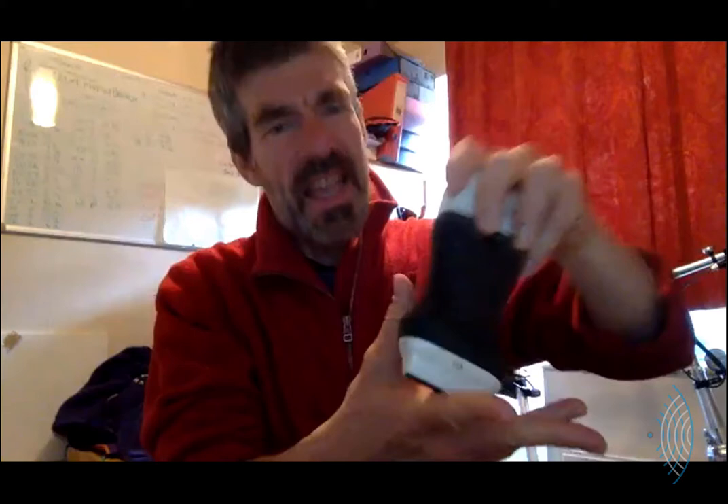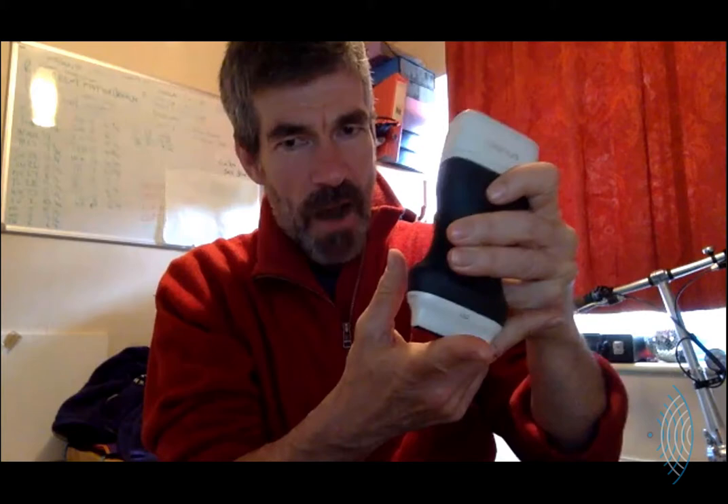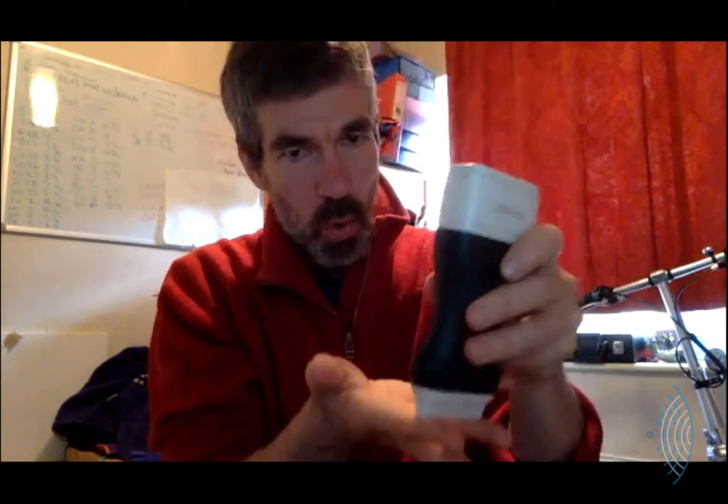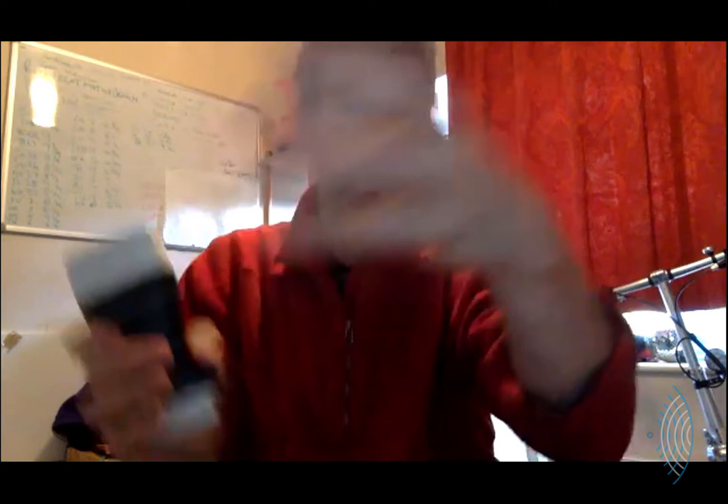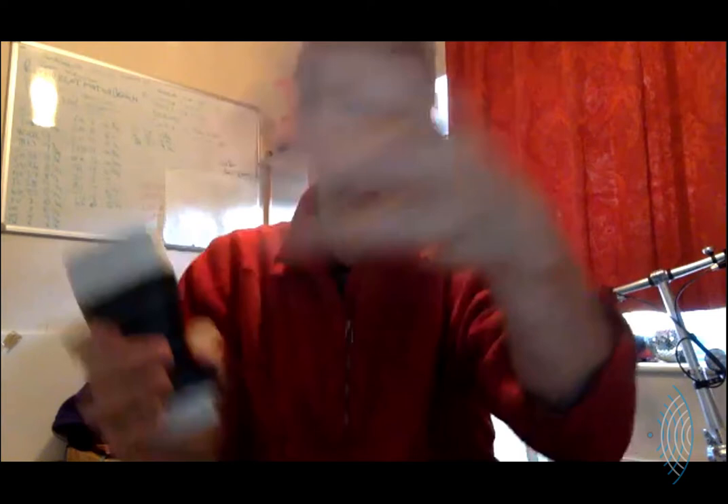I'm not trying to use my anatomical model to tell me where the tissues are. You're looking at the nuances from what's coming from the image. I look at the biceps tendon — whatever the bigger tendon is — and because I only move my probe at 90 degrees, it only ever goes like it's on a track. When I'm following something, I follow it like a train; my probe is on tracks. Those tracks bend and go up, but in my mind they are always on a track, because if I'm having to slide just to keep it in the middle, then I'm not pointing in the right direction.